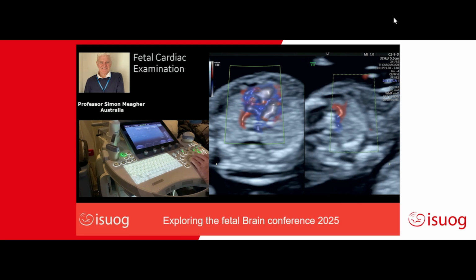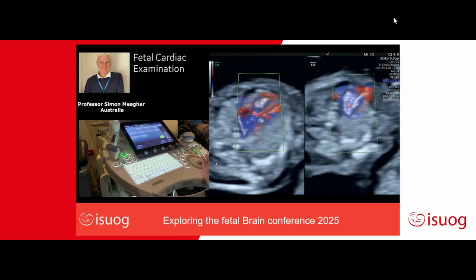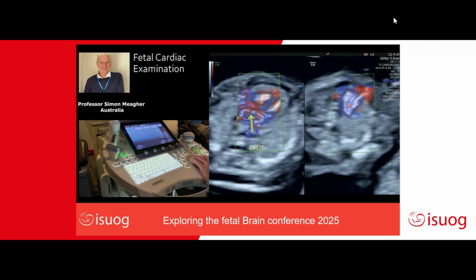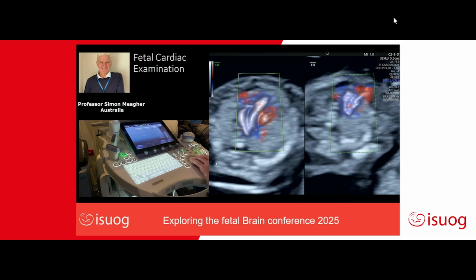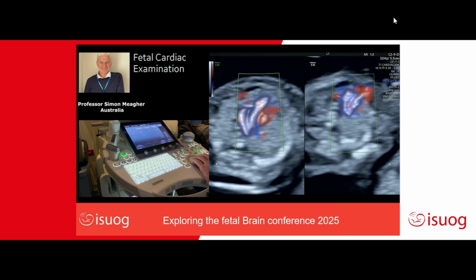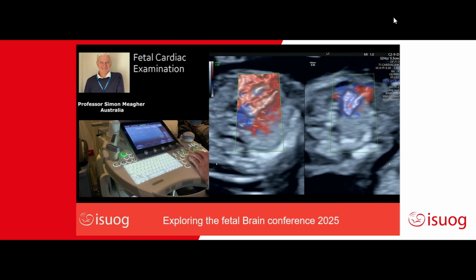You see the baby becoming quite active now, and it does do that with slow flow. And then here you can see the curvature of the left ventricular outflow tract. You can see the aorta, and then you sweep from that to the 3-vessel tracheal view. So on a single use of the cine loop, which is very important, you can change your section from the 3-vessel tracheal to the left ventricular outflow tract, and then down to the 4-chamber. So I'll just update that.